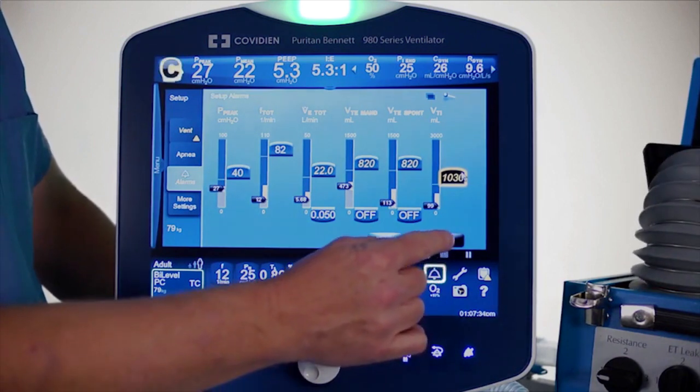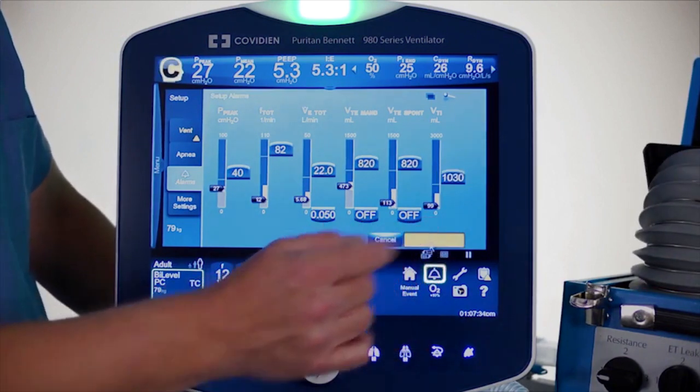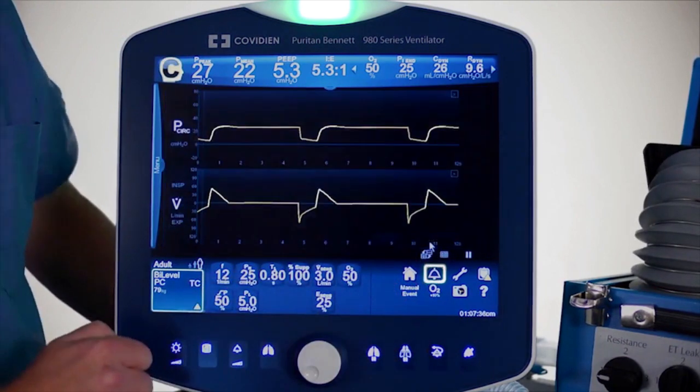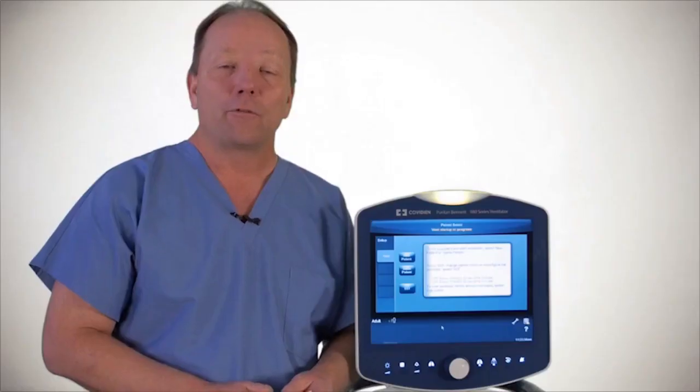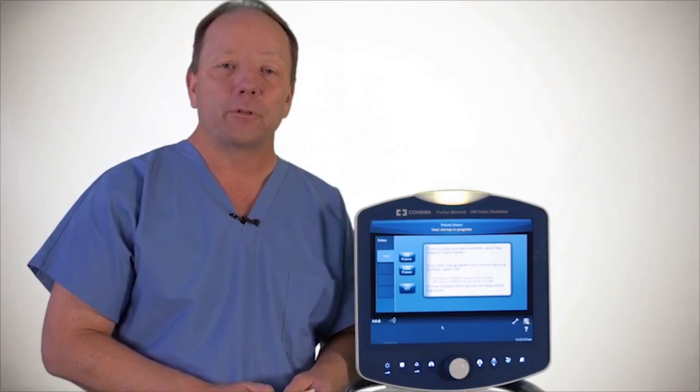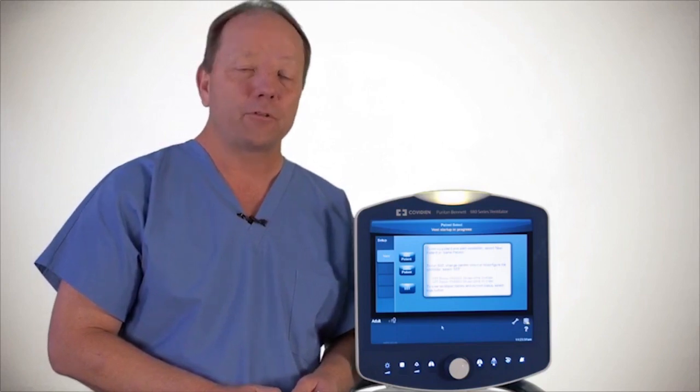Make sure all alarms are set appropriately, then hit the accept key. For further information, please consult the operator's manual.